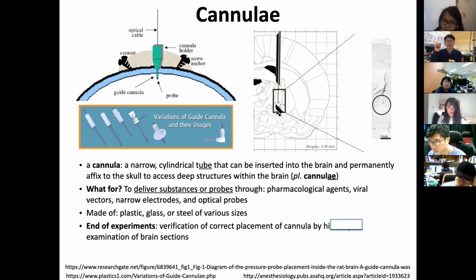The virus does a good job of infecting cells so that we can insert a neuron-specific activity indicator or fluorescence indicator, and then we inject, and later on you can check, do imaging, and do electrophysiology. Or you can also insert a narrow electrode. You can put an electrode anywhere inside the brain so that you can measure the electrical activity of the brain.